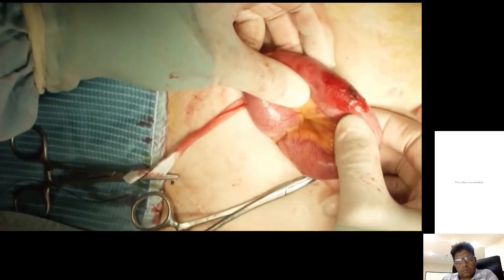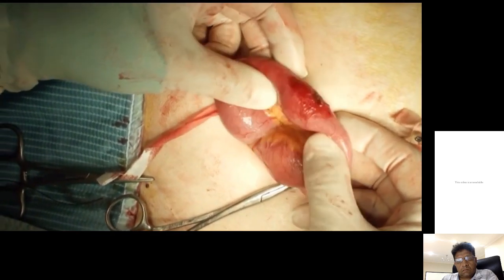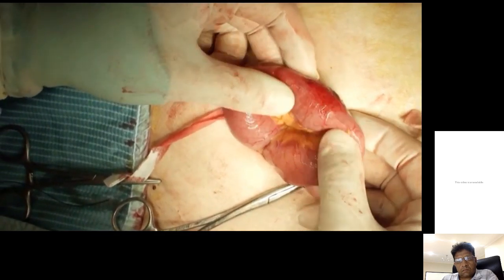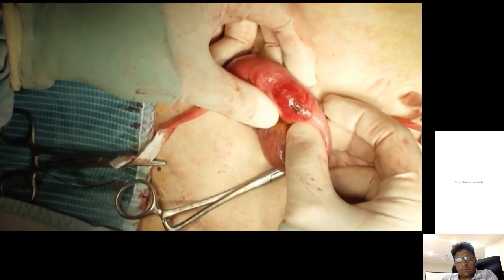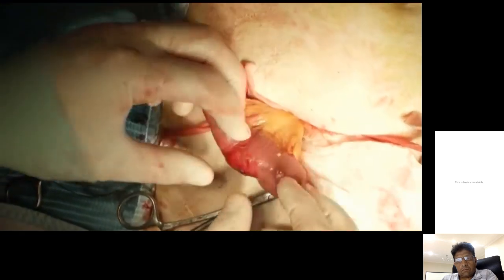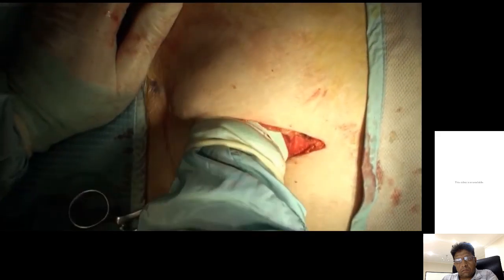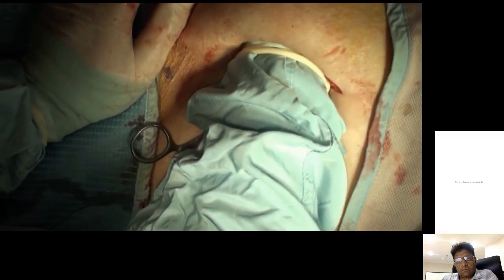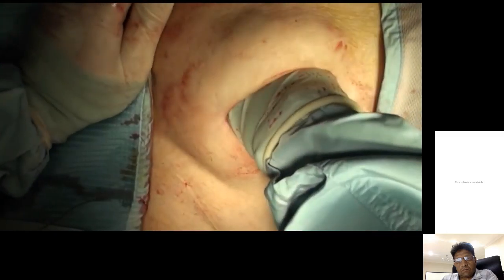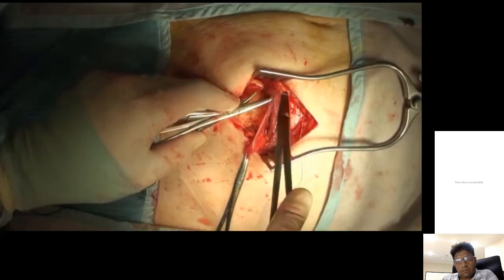As any Richter's hernia. The only argument for resecting this really would be if you were really unsure, but I think we're pretty happy about that. And the other argument being that if you have an ischemic segment of small bowel, there is a small risk of it stricturing later on, but I think we're happy with that. Liver feels fine. Some rocks of stool in the colon. Stomach feels fine. Nothing grossly abnormal elsewhere to touch.